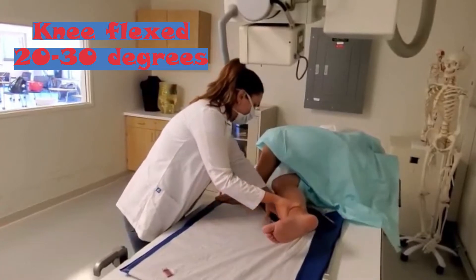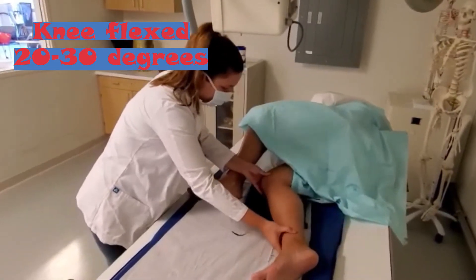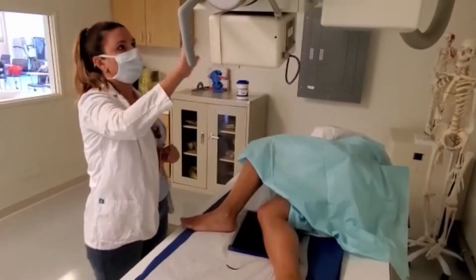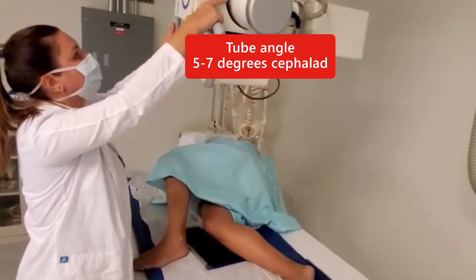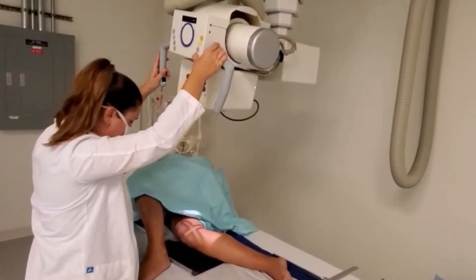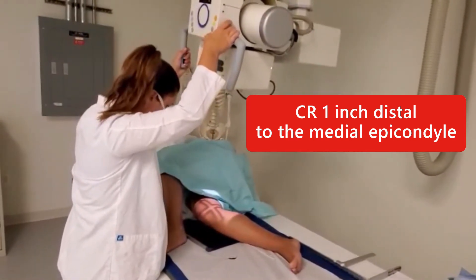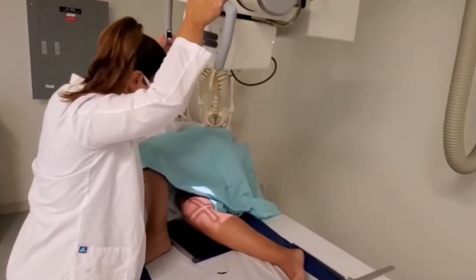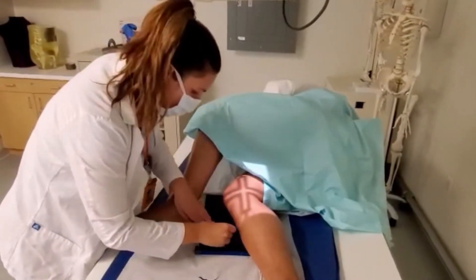We place the IR under the knee, still making sure that the patella is perpendicular to the IR. We angle the tube 5 to 7 degrees cephalic. Our central ray will be entering 1 inch distal to the medial epicondyle. We can adjust the alignment of the collimator and the tube so we have a beautiful image. Collimate and put your marker.